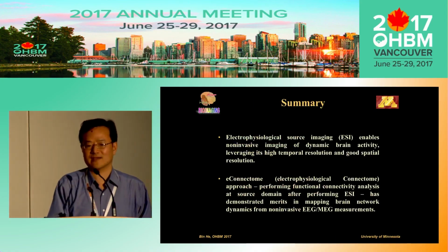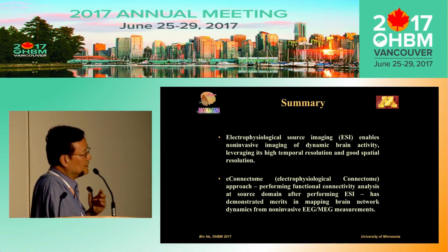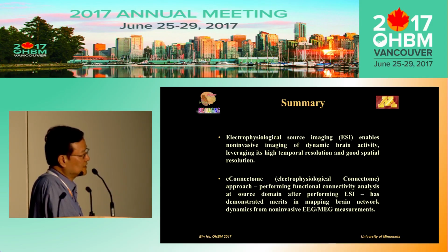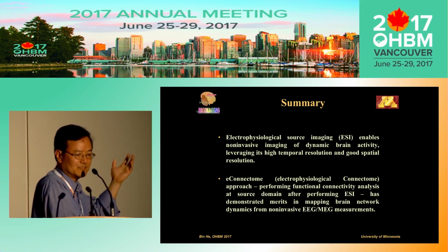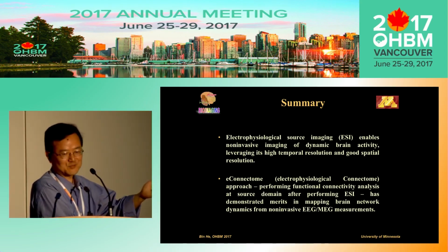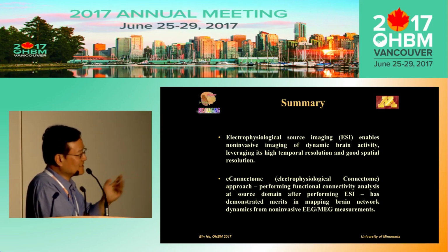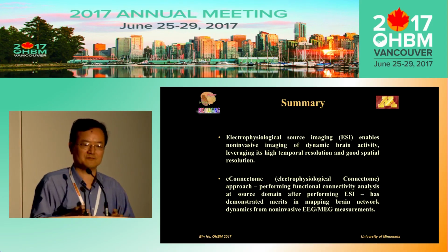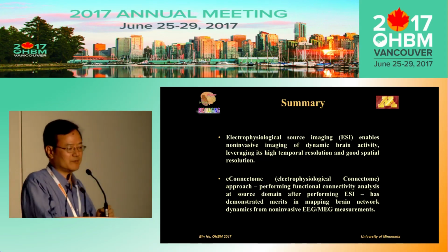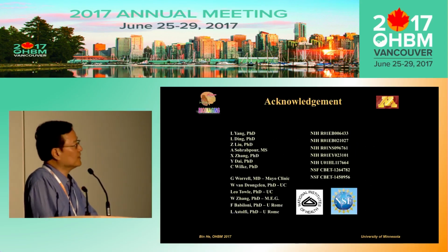So, to summarize: one is that electrophysiological source imaging, or ESI, enables non-invasive imaging of dynamic brain activity, leveraging its high temporal resolution and good spatial resolution. The electrophysiological connectome, for some reason I call it the E-connectome, by learning from the United States' Human Connectome Project. I try to make it simple, okay? You can like it, you don't have to like it, but this E-connectome approach performs functional connectivity after solving the source imaging problem of EEG and MEG, and promises to provide additional information on what we are doing.